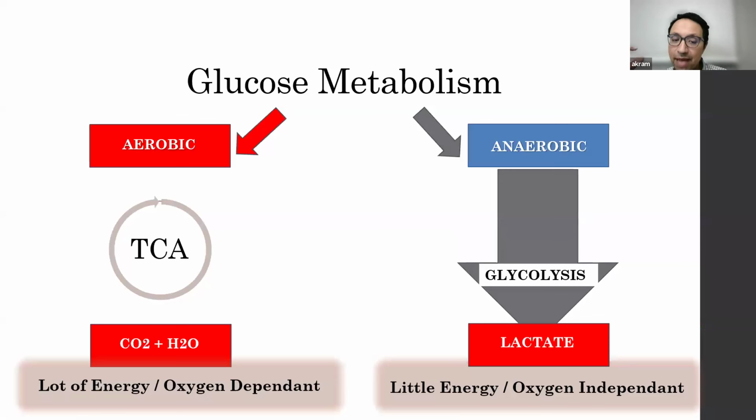The main issue is to shift back from the anaerobic metabolism which happens due to decreased oxygen delivery. The decrease of oxygen delivery occurs in cases of hypoxemia or in cases of severe myocardial depression. We shift back to aerobic metabolism by promoting oxygenation of the body and preventing tissue hypoxia. The hallmark of a successful ECMO run is lactate washout, as lactate is the outcome of anaerobic metabolism and is washed out when oxygenation is maintained using ECMO.